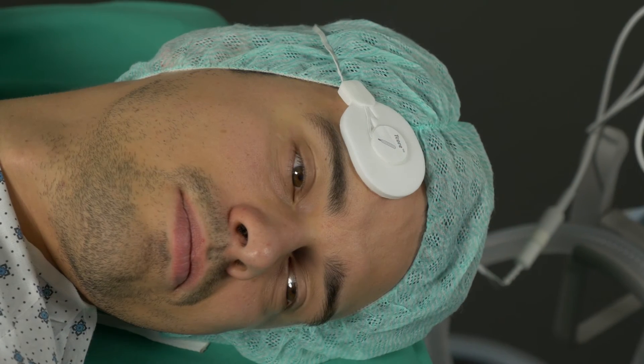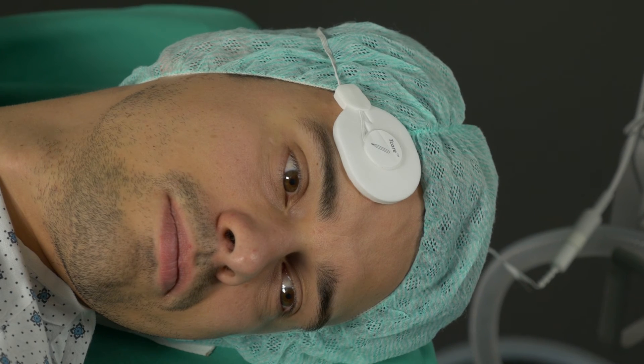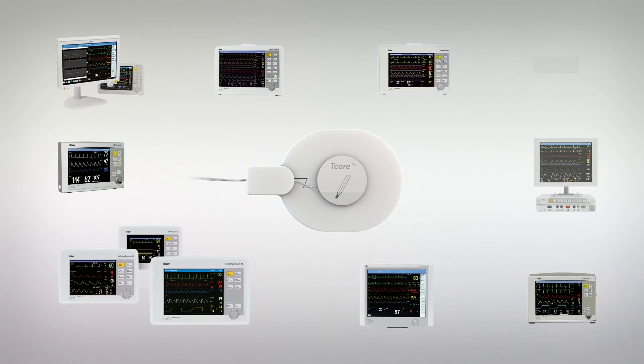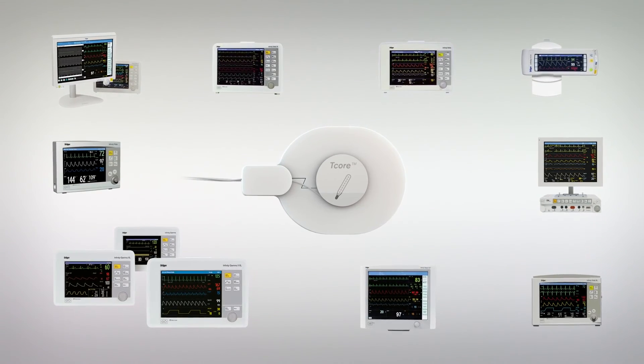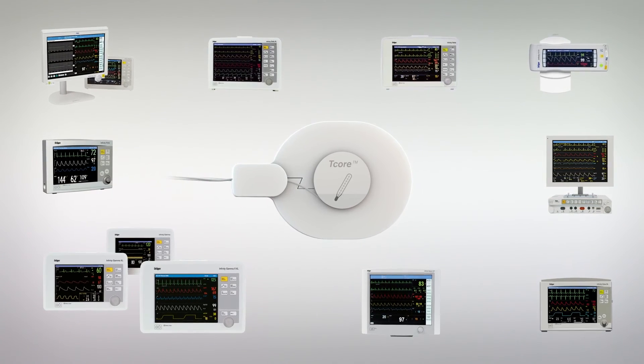The Drega T-core system combines the simple non-invasive application with the accuracy of an invasive procedure. It is easily integrated into the existing Drega monitoring system, and at the same time, documentation in the electronic patient file takes place automatically.